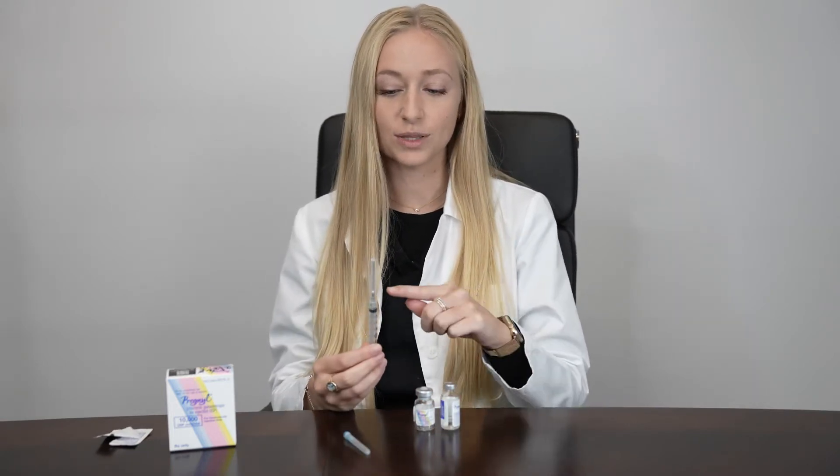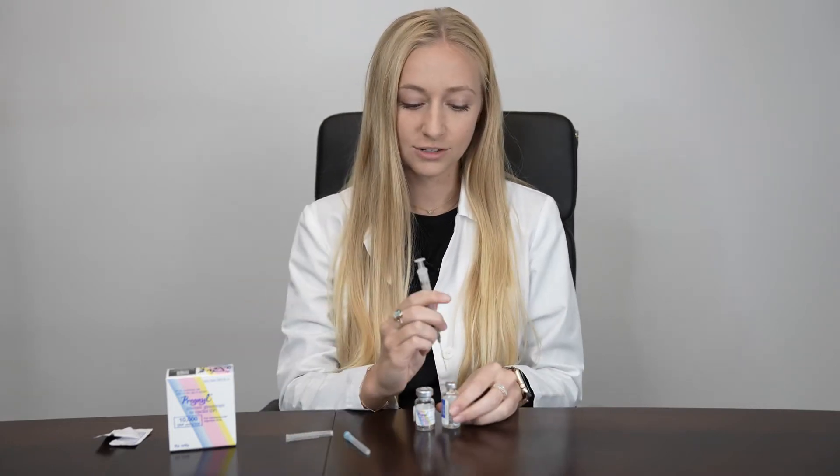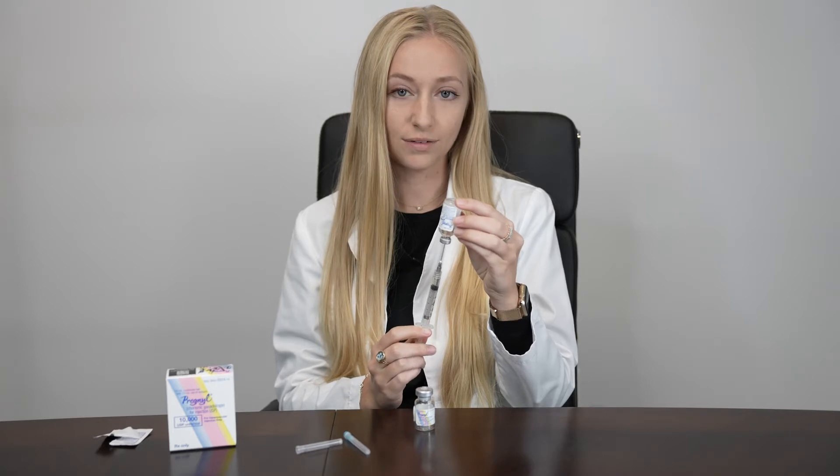If your dose is 10,000 units, you'll have a 3 ml syringe with a 1.5 inch 22 gauge needle. Insert it into your vial of liquid, flip it upside down, ensuring that the tip of your needle is submerged in the water, and then pull out 1 ml of the liquid.